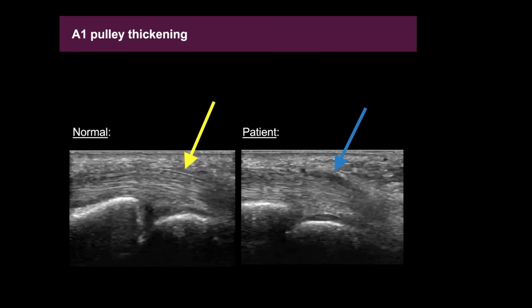And you can see those images by comparing the left-hand side of the image and the right-hand side of the image. And I usually do contralateral examinations in these patients. So if the patient's having left hand pain, I look at the right hand to compare so that you can increase your confidence that way, because if it's thickened on one side and normal on the other side, then, well, I think your confidence goes a lot higher than if it looked symmetric on both sides.